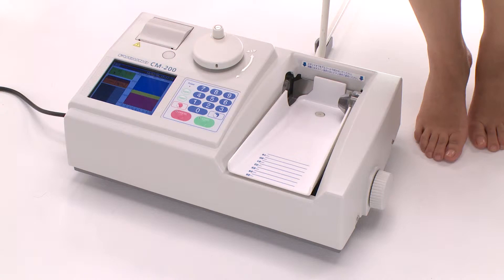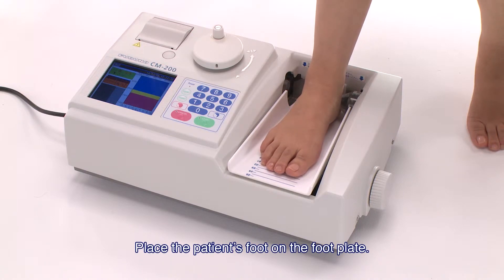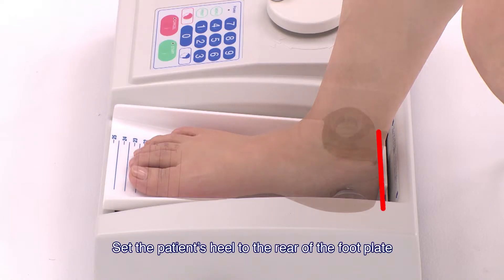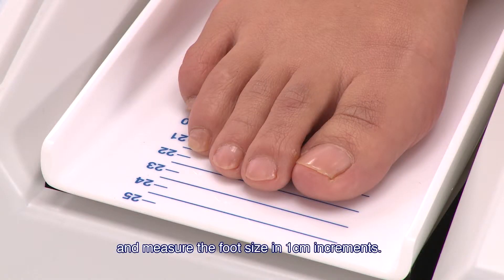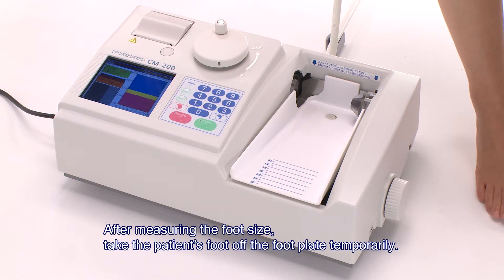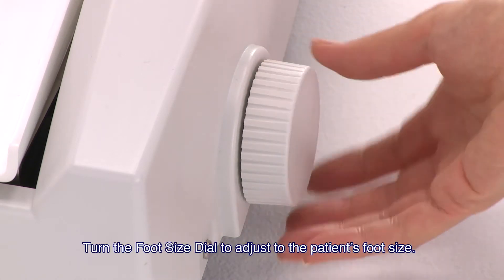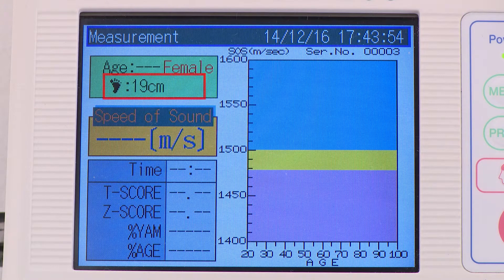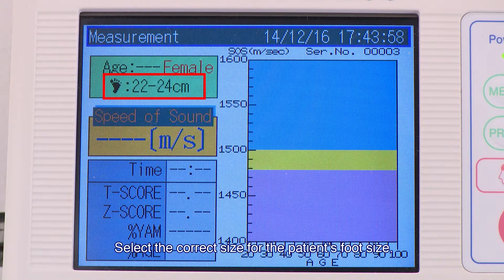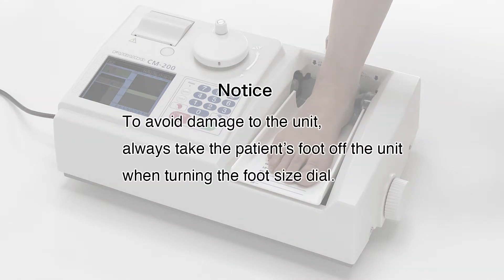We will now proceed to preparation for the actual measurement. Place the patient's foot on the footplate, setting the heel to the rear and measuring foot size in 1 cm increments. After measuring, take the patient's foot off the footplate temporarily. Turn the foot size dial to adjust to the patient's foot size — sizes are displayed in 5 steps on the screen. To avoid damage to the unit, always take the patient's foot off when turning the foot size dial.